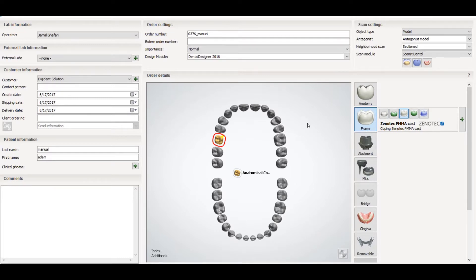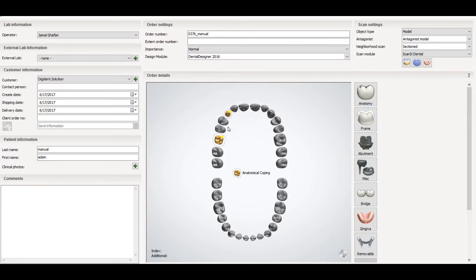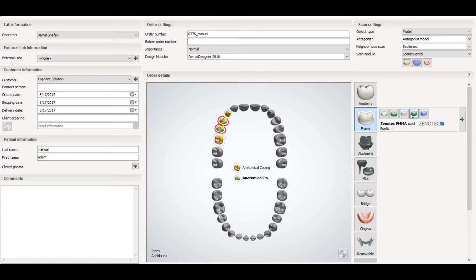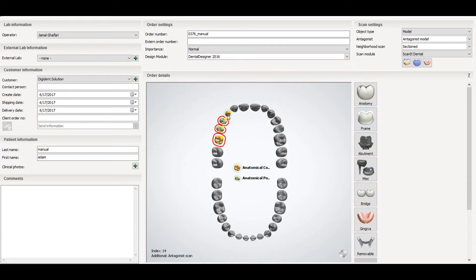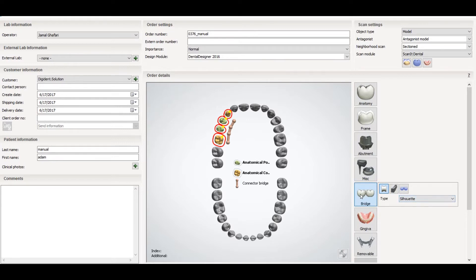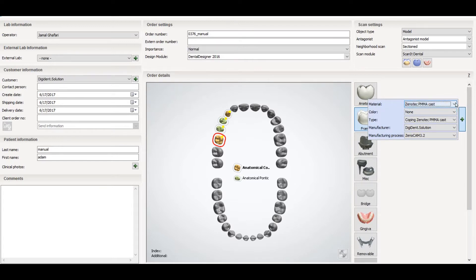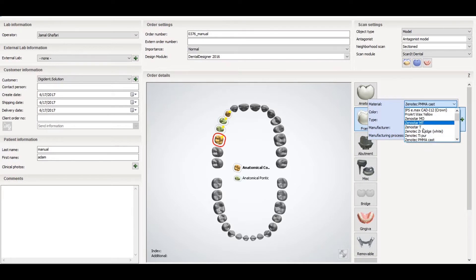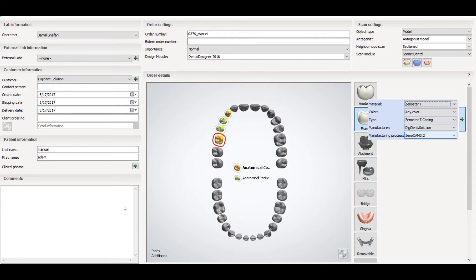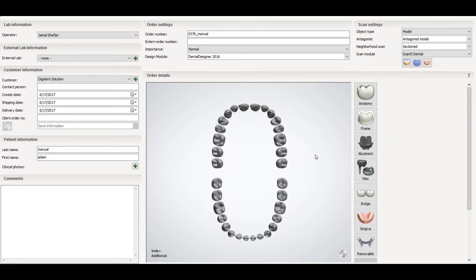To make a bridge with frame, just select the teeth you have, then select the pontic, then select them all again with a left click and go to bridge to make the bridge. When selecting, you need to check your material and the manufacturer process.